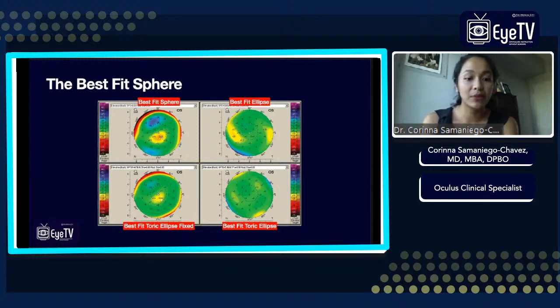Other surfaces can be chosen, and while some of these surfaces may have some utility, they lack the intuitive ease of visual inspection of a BFS. As seen in this example, the best fit sphere best demonstrates the island of elevation in a cone compared to the other reference shapes.